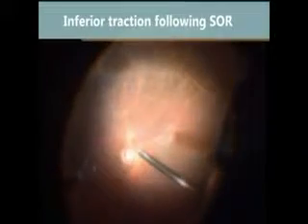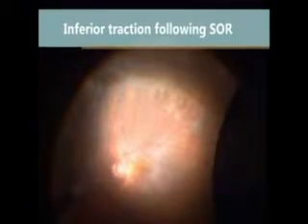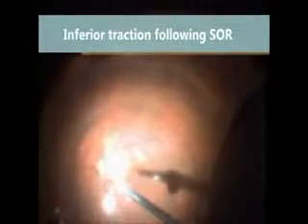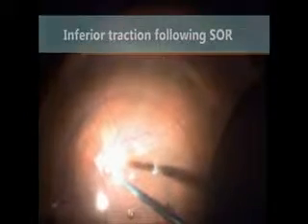This is a case of sub-silicone oil redetachment with stiff inferior retina. PFCL is injected to flatten the retina. Preparatory endodiathermy is done, followed by retinectomy to relax the stiff areas.